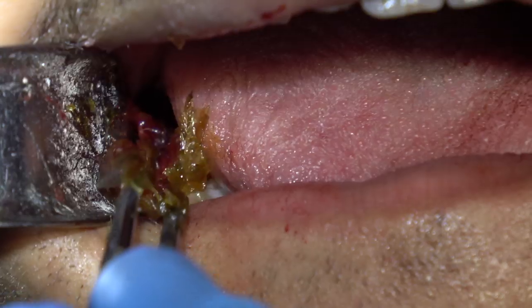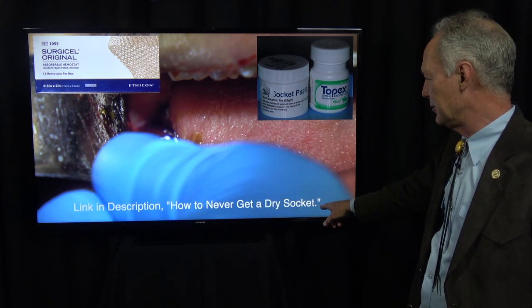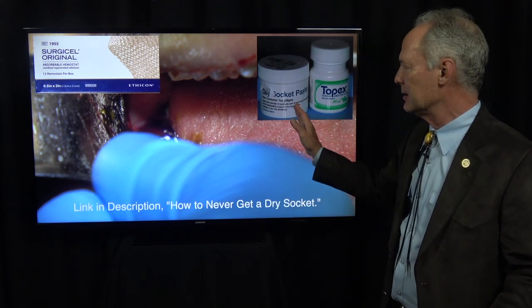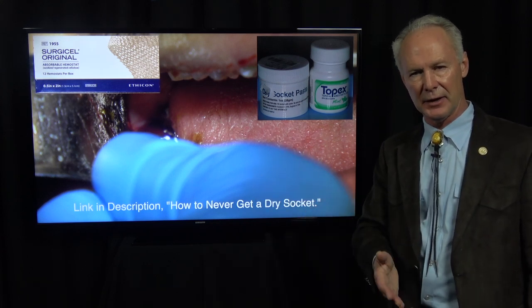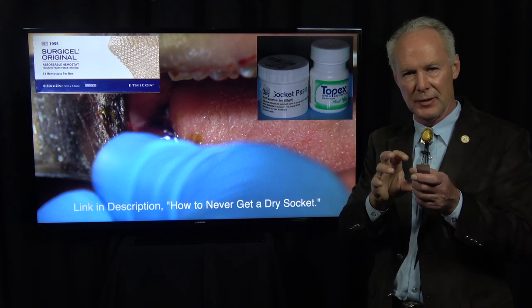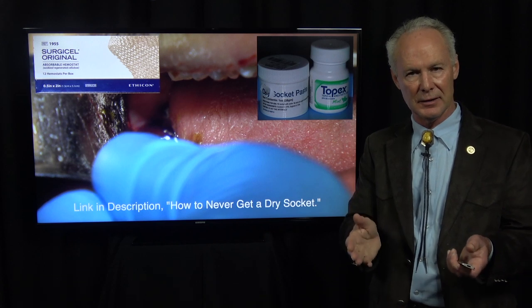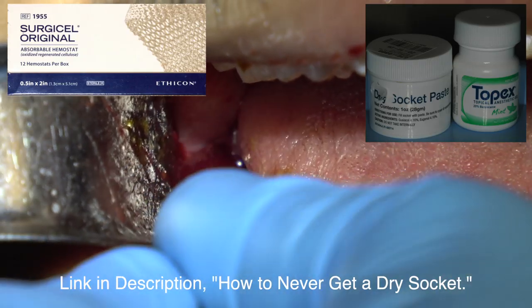Irrigate that out well, then pack the socket with resorbable gauze and socket paste. I haven't had a dry socket in 40 years because I pack the sockets of mandibular teeth — especially wisdom teeth — at the time of extraction. A dry socket is losing all or part of the clot in the socket. The resorbable gauze and socket paste create a matrix for the blood clot so it stays in the socket. It only needs to stay for seven days, because that's how long it takes for connective tissue lining to form.